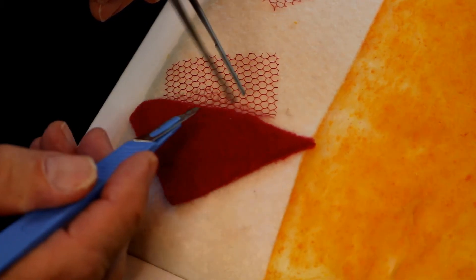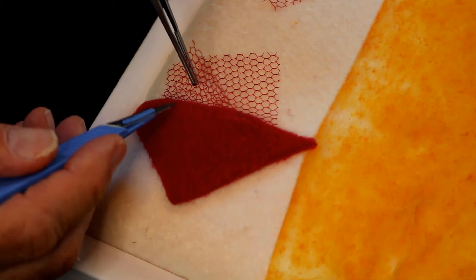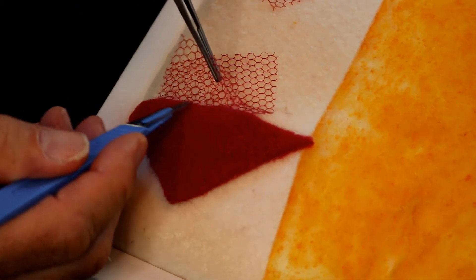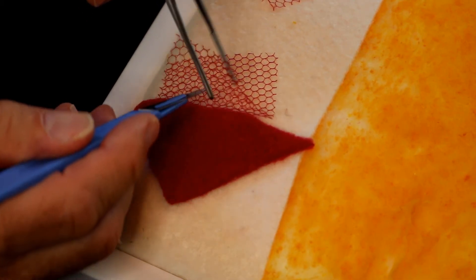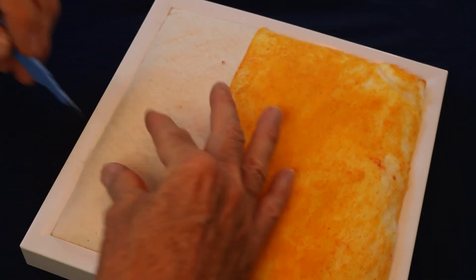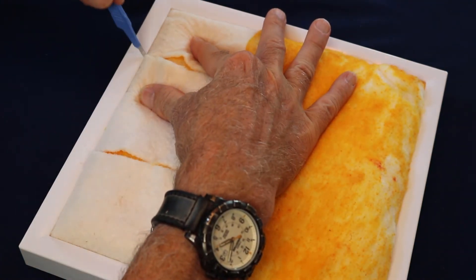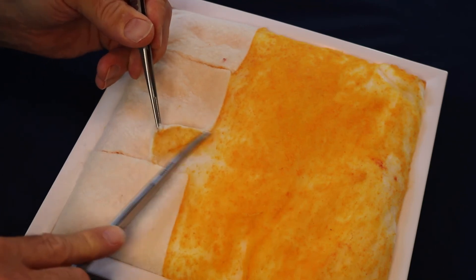For this type of dissection, it is imperative that the length of the strokes be limited, since important structures may be close by. Sudden bleeding can be catastrophic. Once all of the red material has been removed, the remaining white strip should be cut in several sections with a scalpel. It then can be removed from the yellow surface by cutting and spreading fairly easily.